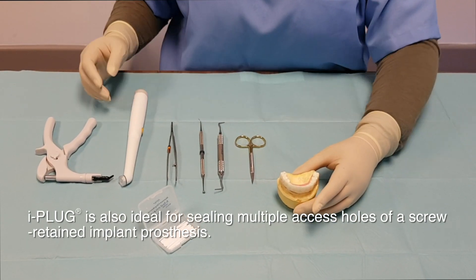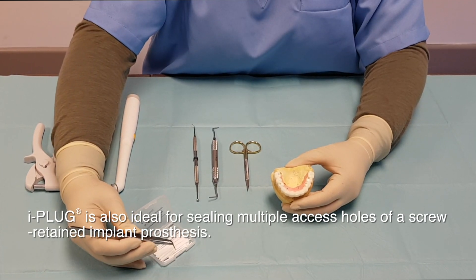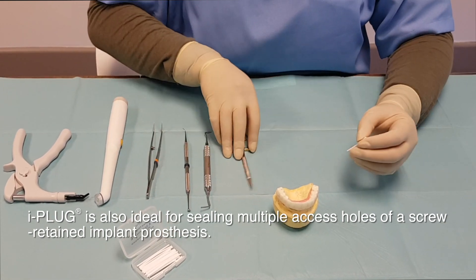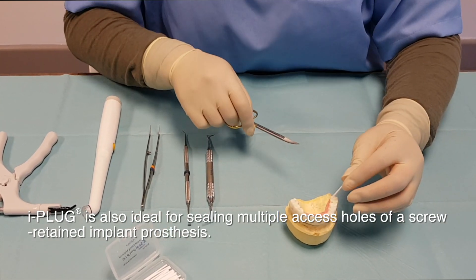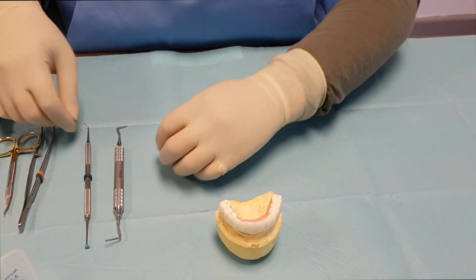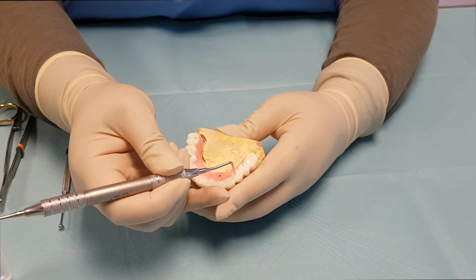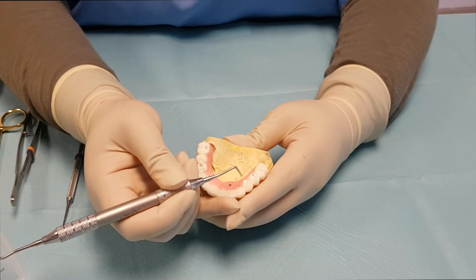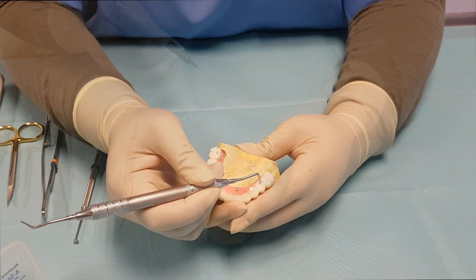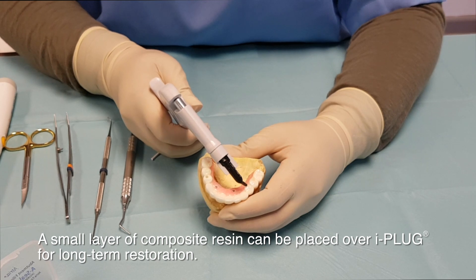iPlug is also ideal for sealing multiple access holes of the screw-retained implant prosthesis. A small layer of composite resin can be placed over iPlug for long-term restoration.